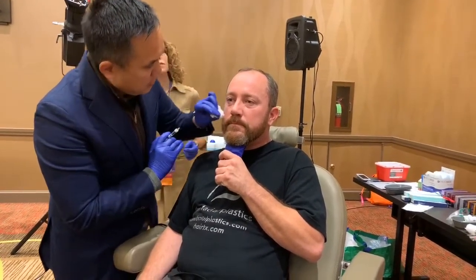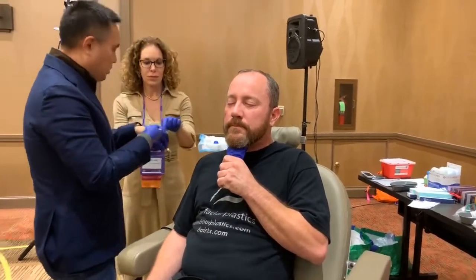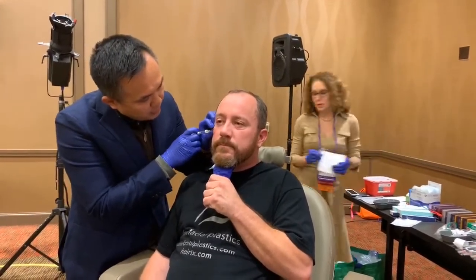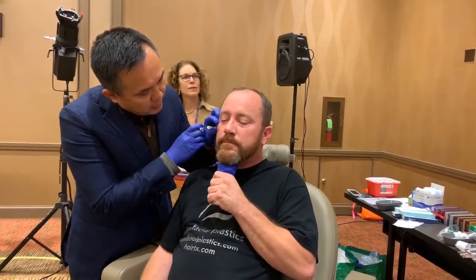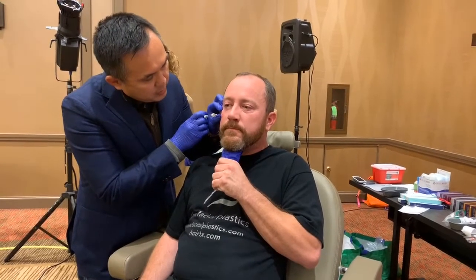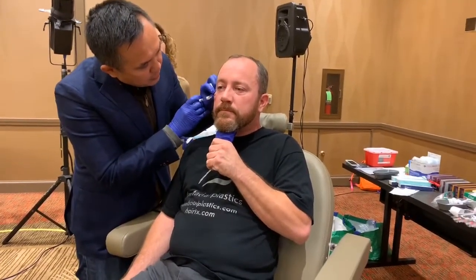There's a little dip horizontally so I'm going to go lateral. Eyes closed for me — I always have patients with their eyes closed. I usually use a 22 gauge for entry; I'm dealing with an 18 but being gentle. Eyes open, look straight ahead — look up: you can see it exaggerates too much; look down: can't see anything; look straight ahead: that's about perfect. I always have the patient sitting looking forward. When I see there's a little dip in the medial or middle aspect of the lower eyelid, I'll go ahead and address that.